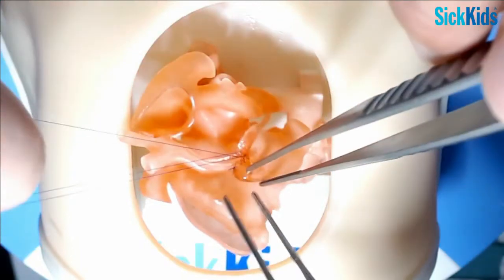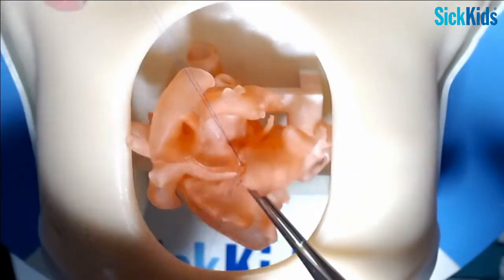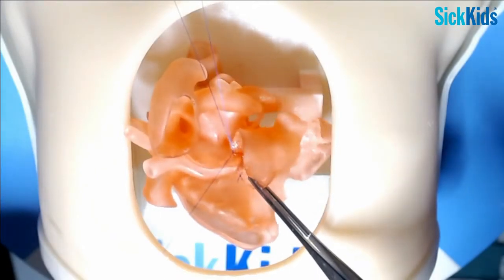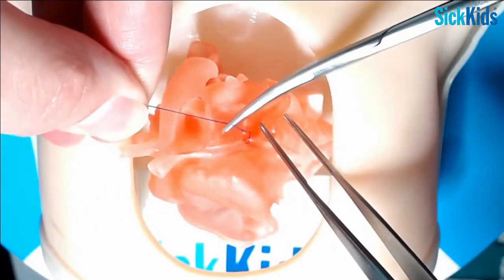Let's tie this one. It's hard to see on these models, but as you can see, that opens up that base of that ascending aorta really well when you use this technique. It's just a color contrast issue.